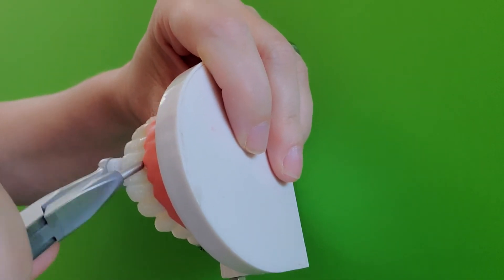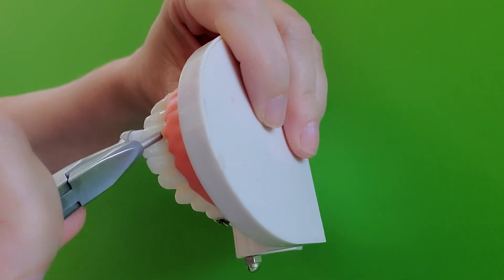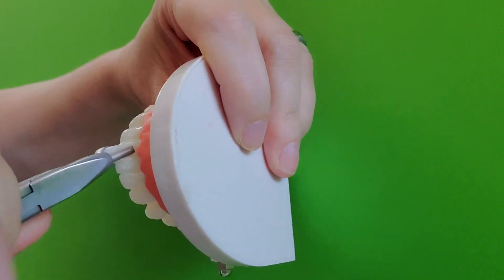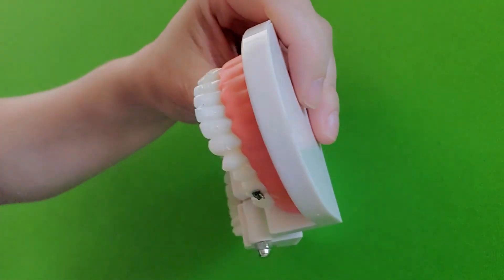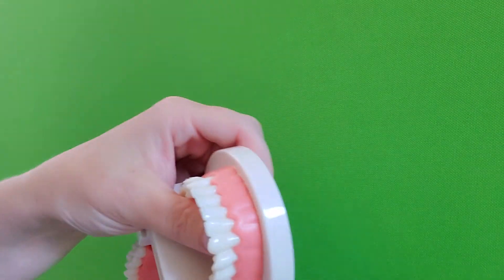I don't know if you can see it flying as I do it. It actually works way better on actual teeth than it does on this acrylic right here. But yeah, that's pretty much it.